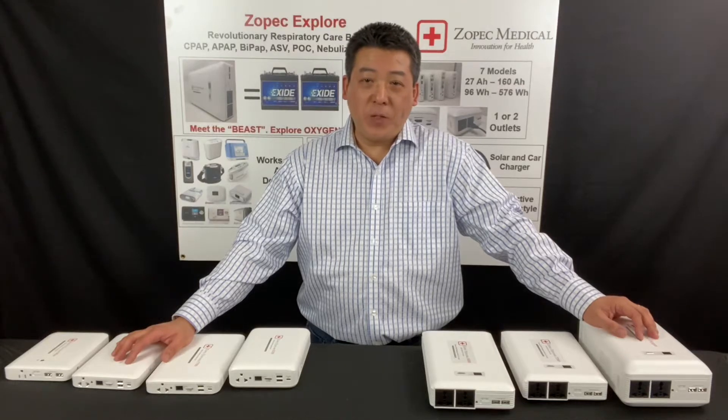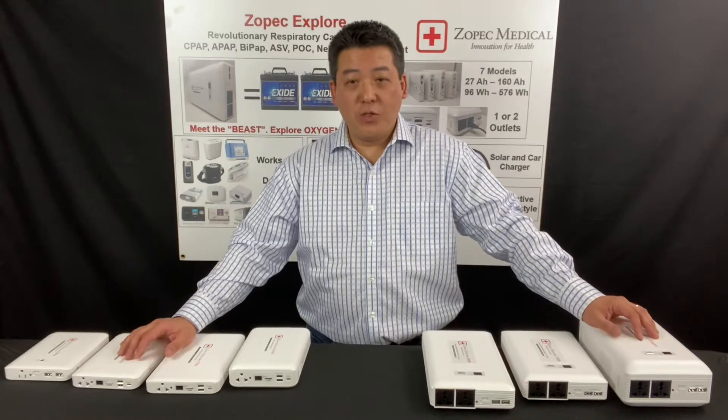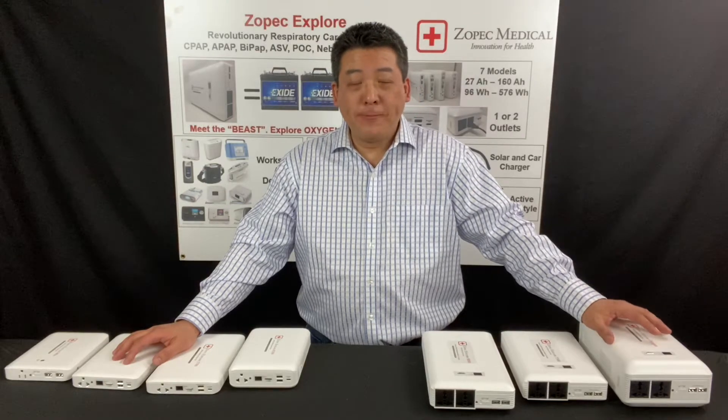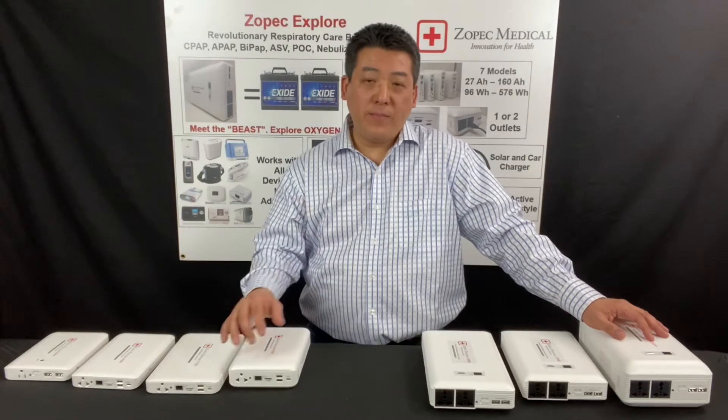Hi, my name is Strong. I'm the CEO and battery designer for Zopec Medical. This video will introduce you to our Zopec Explore CPAP batteries, as well as help you to select the right battery. I'm a CPAP patient, and I love helping other CPAP patients.